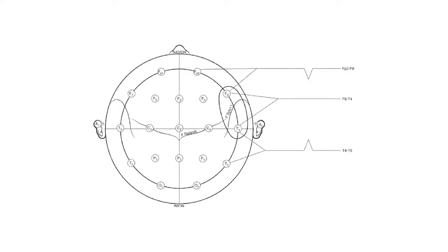and maybe less important for the decision-making that one needs to be considering in the acute use of EEG. I think one point that you're going to hear repeatedly during this educational session is that use of EEG should not be restrained by getting deep into the details of the EEG, but EEG needs to be used in a way to allow for quick and accurate decisions for patient care. Understanding some of the fundamentals that I've described here can be helpful, but should not be in the way of the decision-making. So ultimately, better decision-making can come from understanding the fundamentals, but the idea is the democratization of EEG is the purpose here.